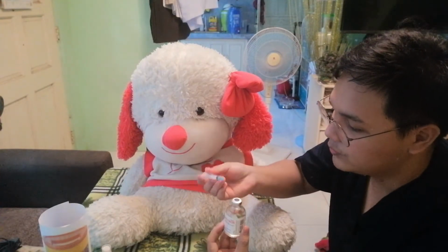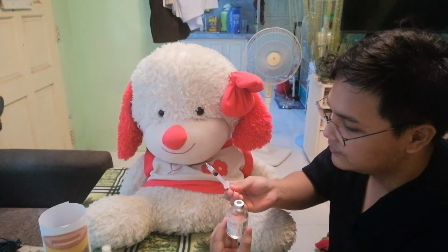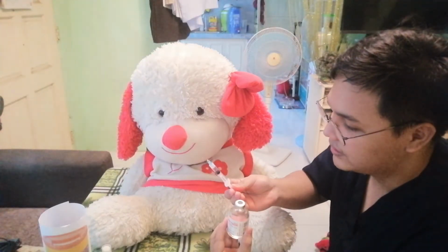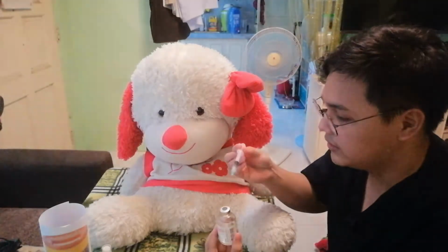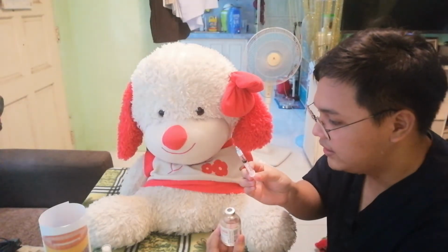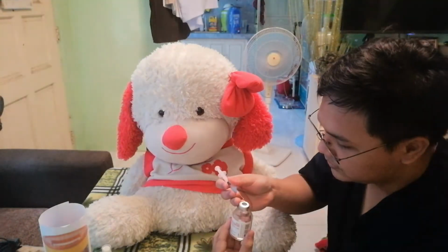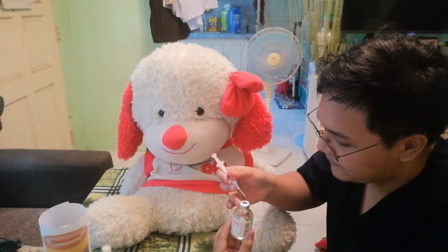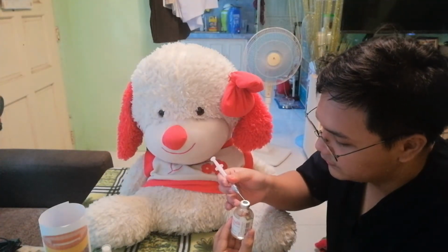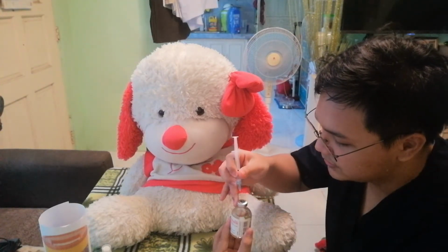First, we need to withdraw the amount of air equal to the amount of medication that we'll be getting from our vial. Okay, so we will be getting 1 ml. Okay, now we will insert our needle. Okay, 45-degree angle going to the 90-degree angle upon insertion.